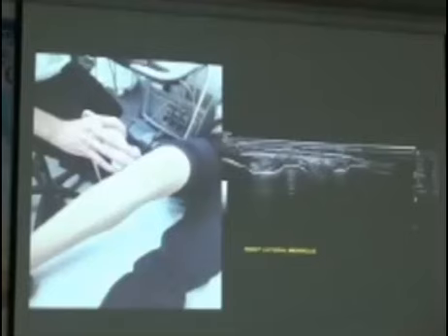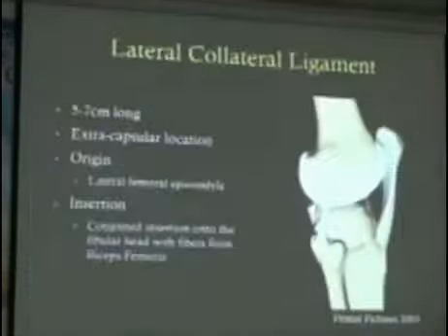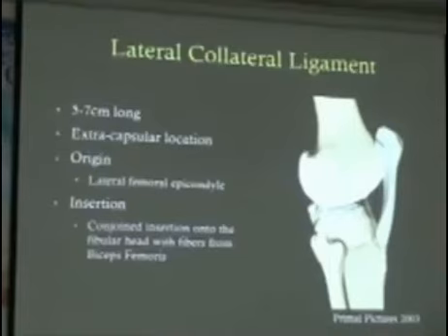So the lateral collateral ligament, it's extracapsular in nature. And down here at the distal insertion, it actually has a conjoined insertion with fibers from the biceps femoris.